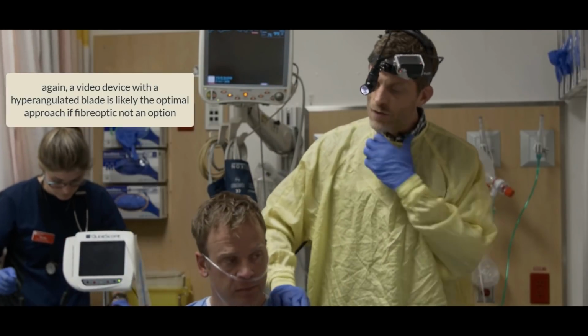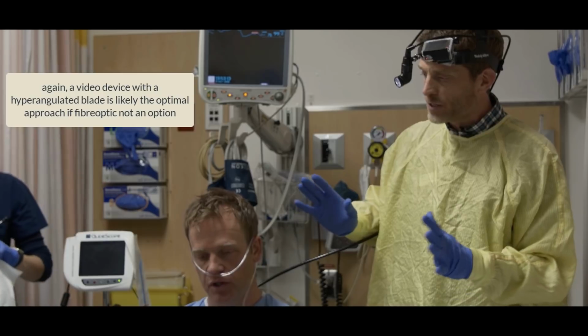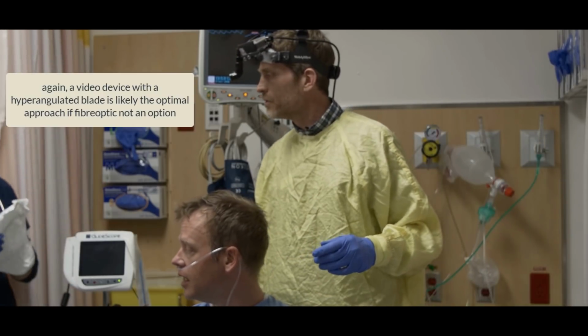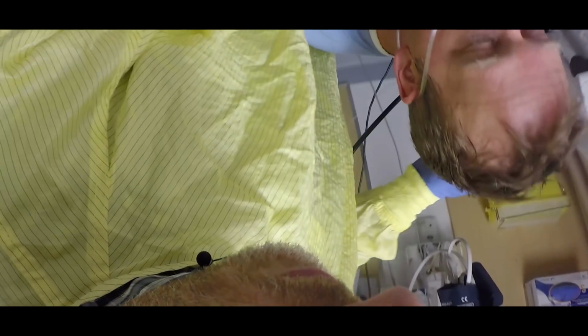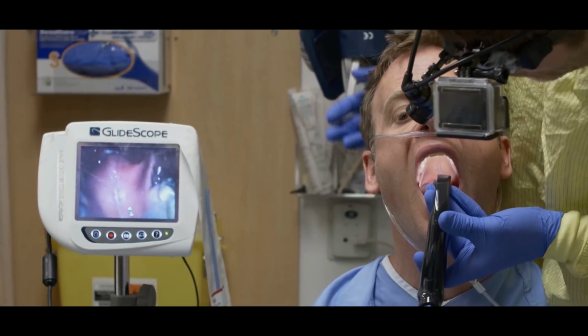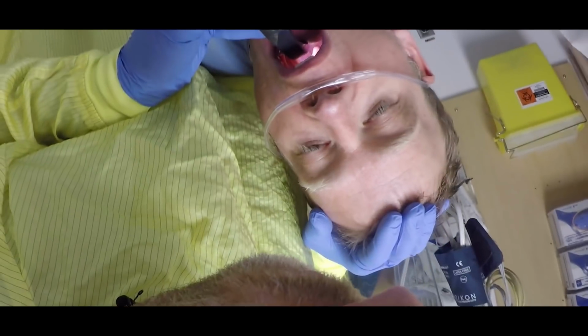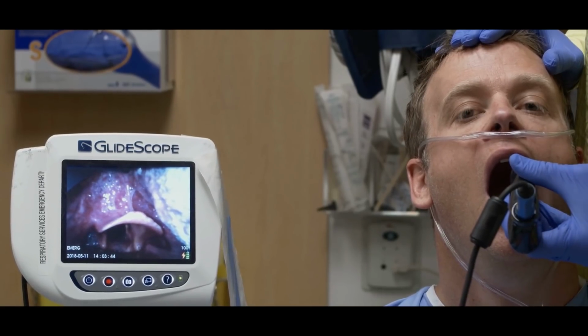You're feeling some pressure from me pushing, but as far as other airway protective reflex? There's no gag, but yeah, just pressure. Okay, so let's try the glide here. So now, hopefully you guys can see the screen. So you can see the epiglottis there, and there's certainly a grade 2 view of his cords.